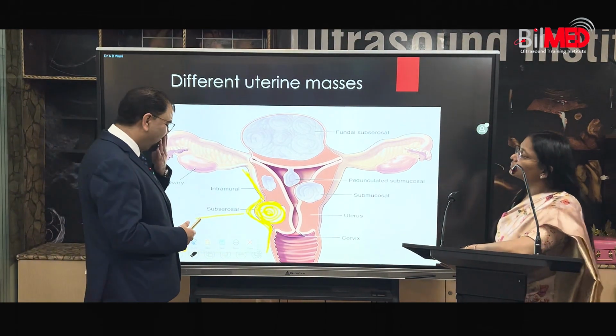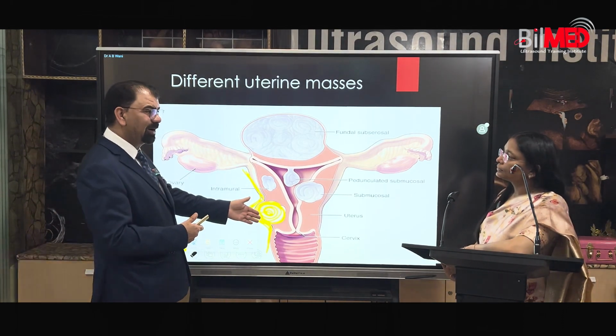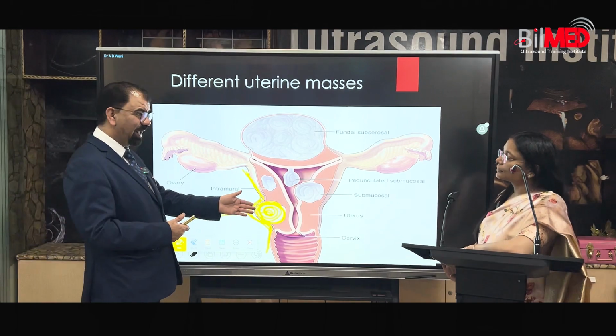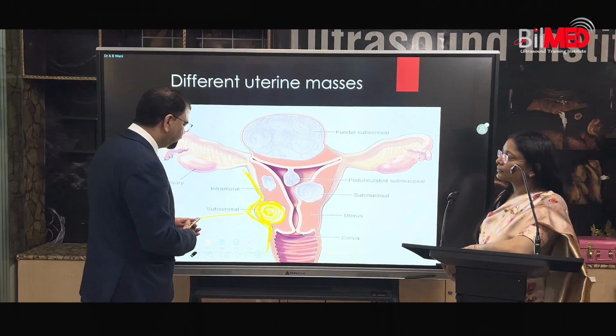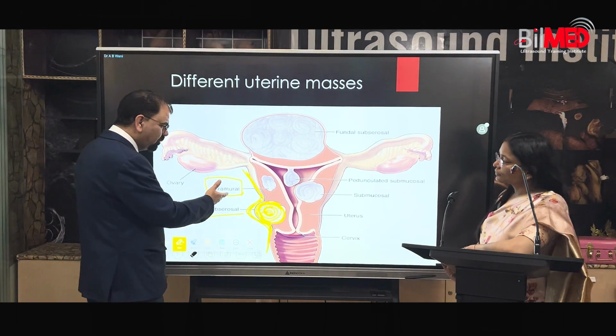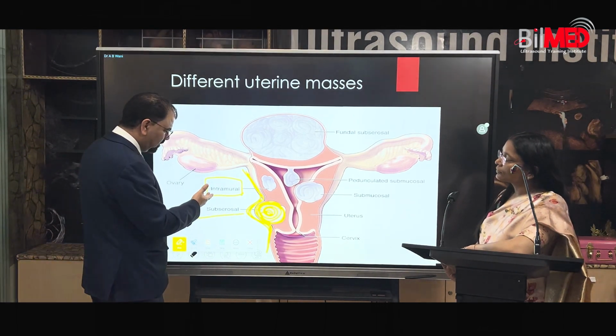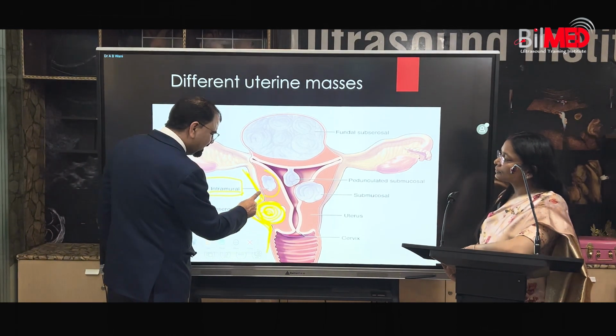So the point is, if you are having a distorted contour, you will search for a fibroid now. You will search for the fibroid, and you know why to search. Subserosally. Now, another type of fibroid, intramural.